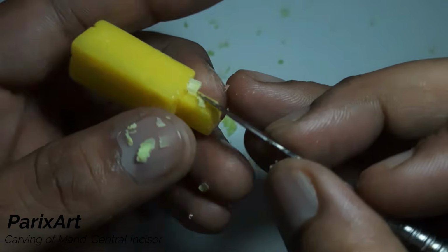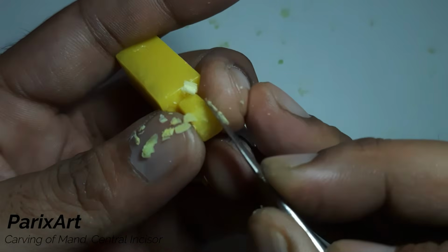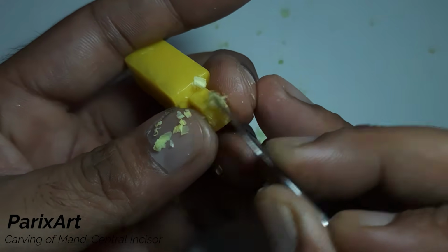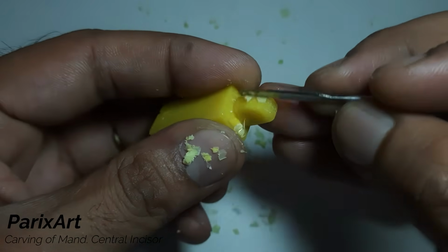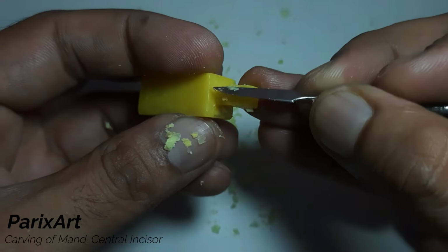Now keep a straight angle from the incisal edge to the crest of contour to develop the labial plane. Carve to the full width of the crown to avoid development of such bumps. Our goal is to connect the incisal edge to the crest of contour.